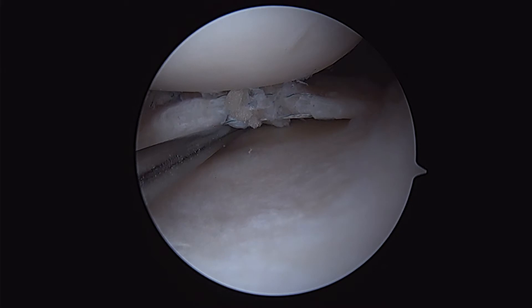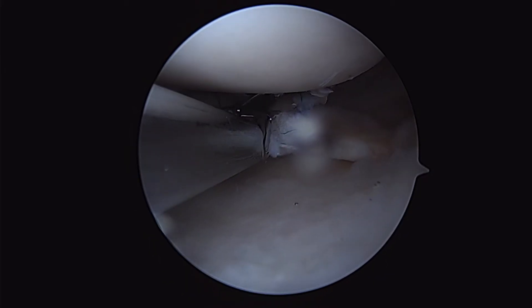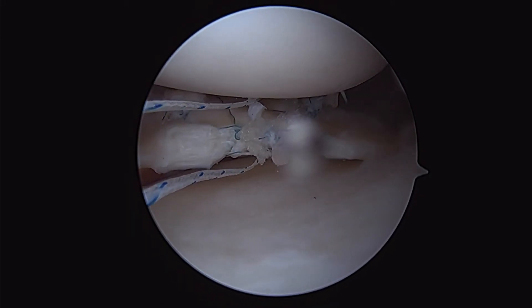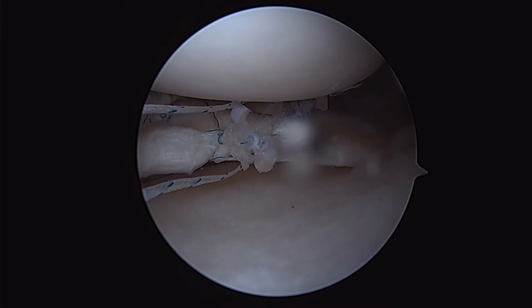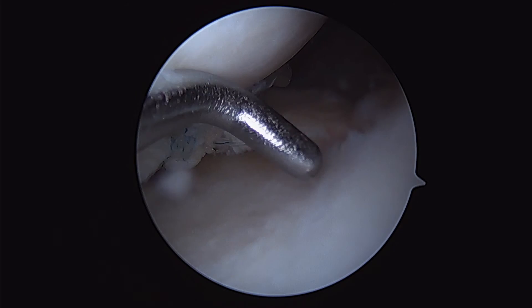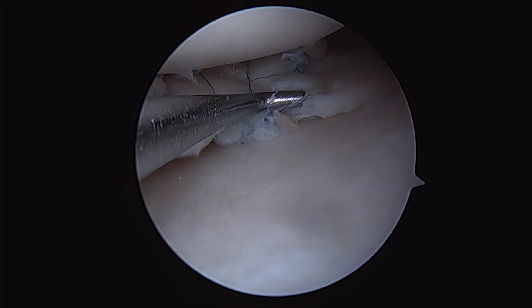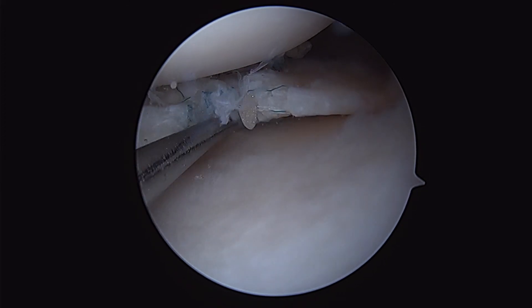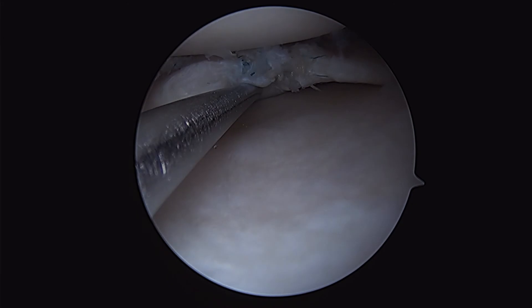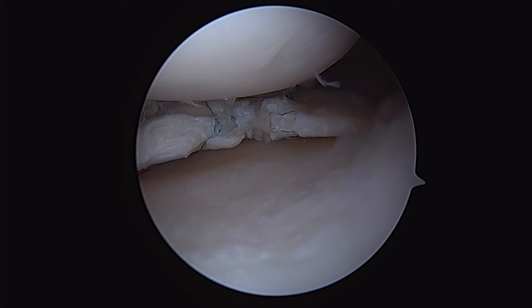Lastly, I'm going to pass one more vertical mattress suture. This is called a hay bale, which goes all the way around the back, and the anterior edge is left free to compress the sutures back into that radial split and reduce their profile. Here we've got a nice repair of our radial split — we've got rip-stop sutures, we've got vertical mattress sutures, we've restored as much meniscal volume as we possibly can. Then we'll take this knee through a range of motion and we'll have a nice stable repair.